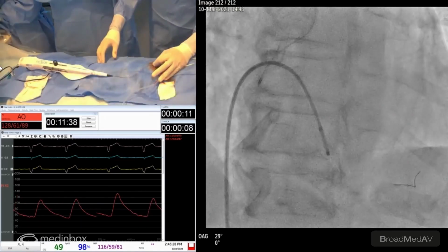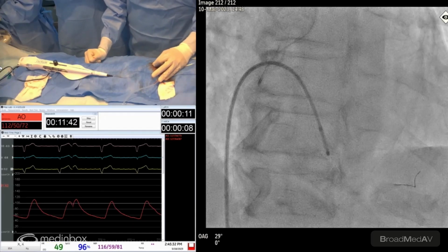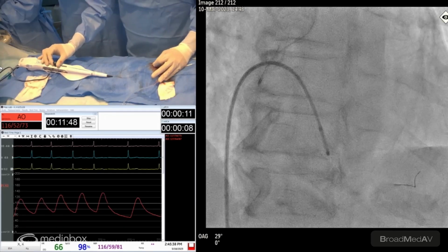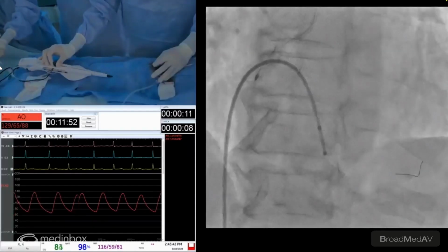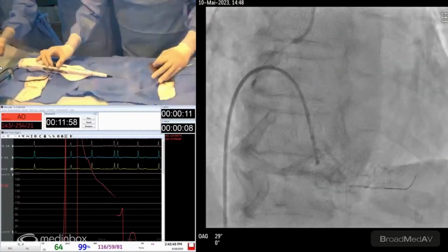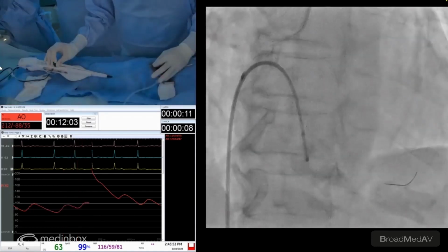Very nice pecking motion. We don't want to go too fast, too slow. There's still a lot of resistance there. I can hear it. I don't know if you guys can hear it, but there's definitely something going on here. Let's take a small test, see what's going on. Ready. Go ahead. Okay. Work in progress. Let's go some more.